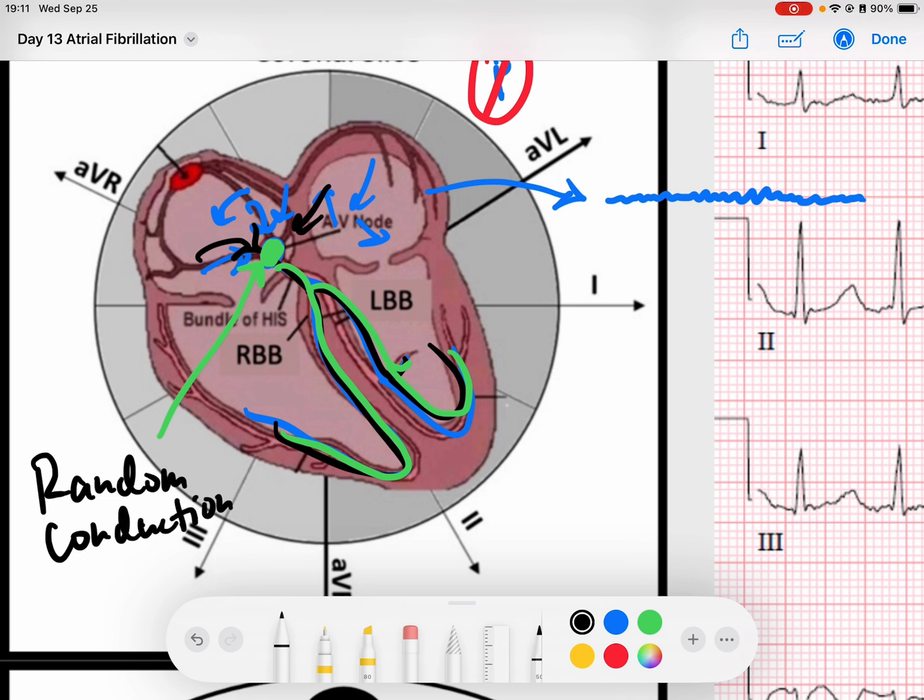Remember in our sinus rhythms, the conduction from the AV node down to the ventricles is very coordinated. We get this nice sinus beat fires off and then it sends signal down. We know the next thing that's going to happen is that signal is going to go down to the ventricles and it's going to happen very coordinated effort. Then the cycle is going to reset.